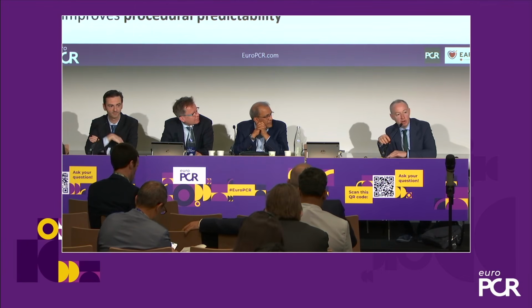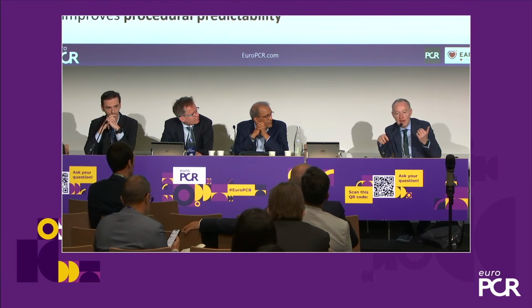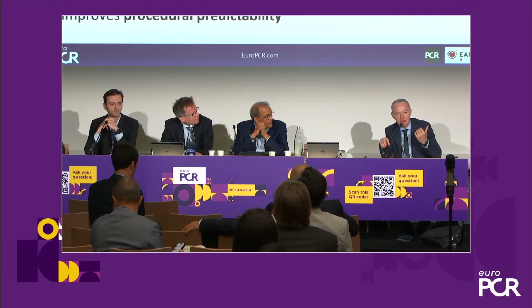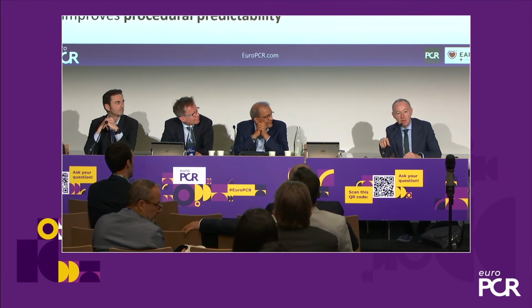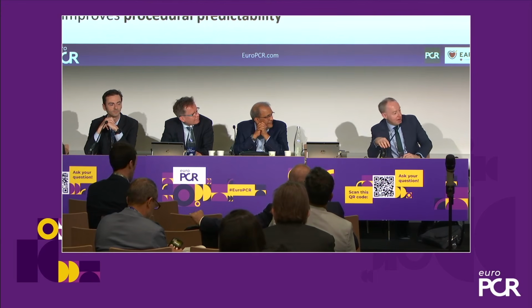And the other thing, going back to the wire, the benefit of having a wire, of course, means you've got direction of travel. Mohammed is one of the best operators I've ever seen in the world, having done cases with him. So I wouldn't advocate using it without a wire in your own home kind of lab. So I hand over to Mohammed to wrap up.